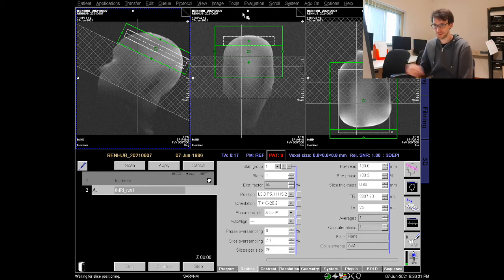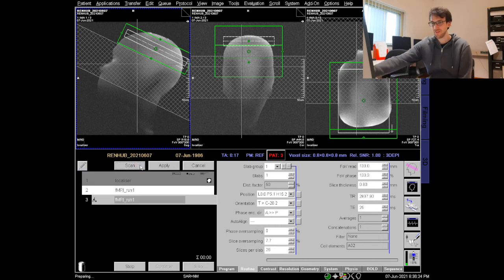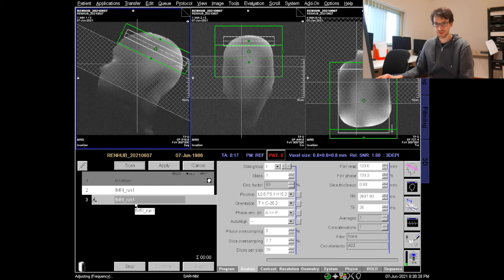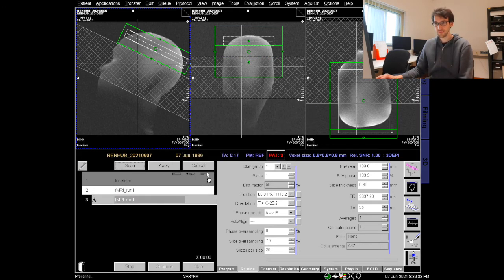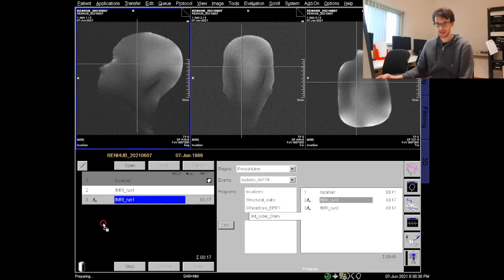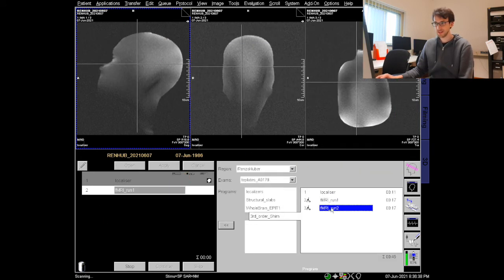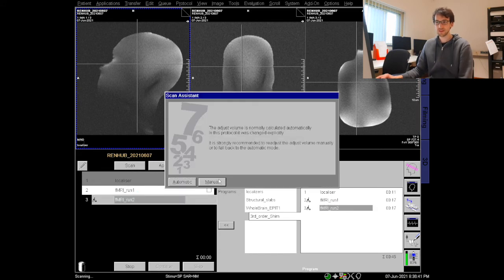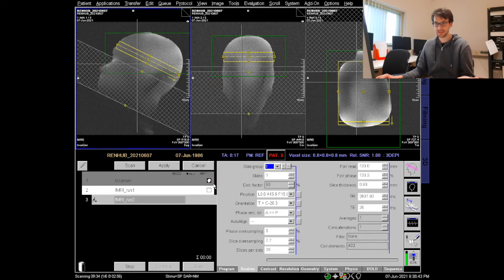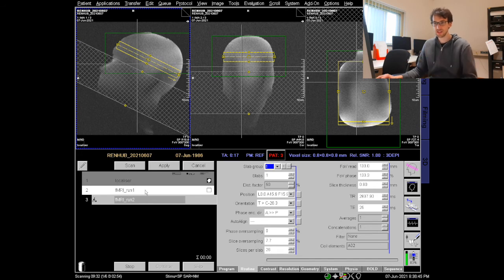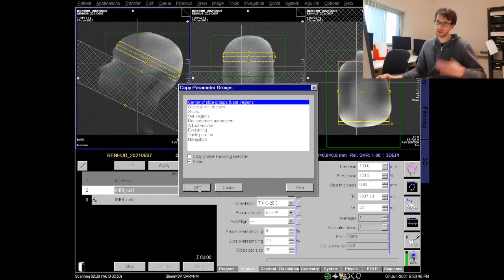So now we have a good set of shim currents and we can actually start our experiment. If you want to use for example another sequence with the same shim currents you can start this here. Let's cancel this one and load in a second run for example and prepare that one. So now the second run should have the same shimming and the same orientations for example.